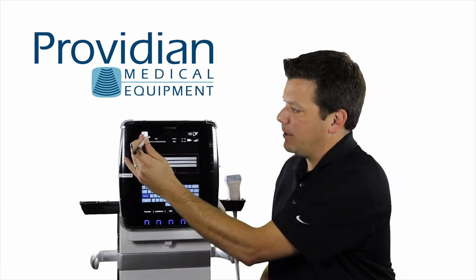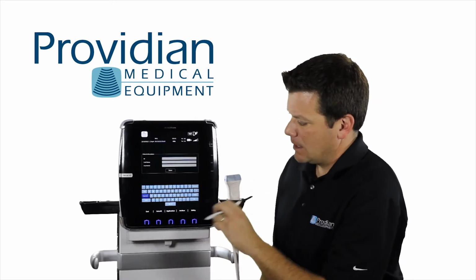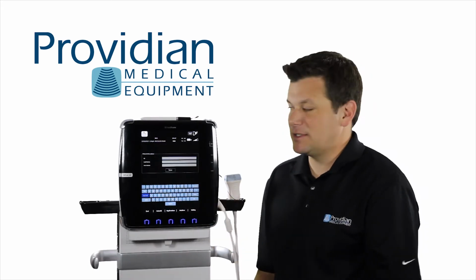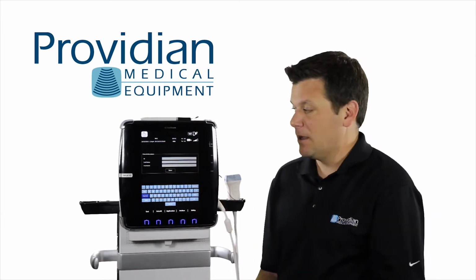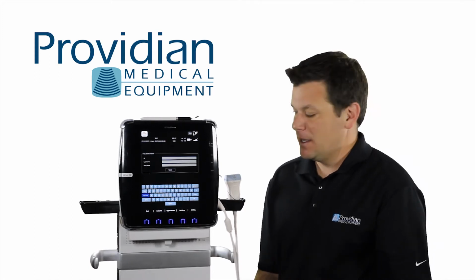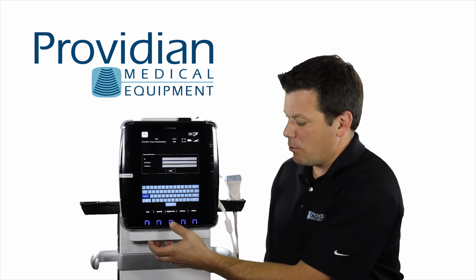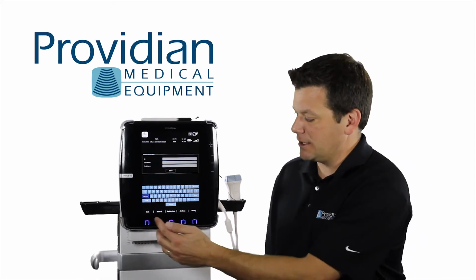We can click up here on the patient again. And notice when I clicked it the second time, we lost all that patient ID. Don't worry, it says test and that remains in there. The only time that's going to change is if I reboot the system or I enter a new patient ID. There really isn't an end exam here. It's just going to let you type in a new ID and that's going to start a new patient exam. Now, if I want to select application, it's going to reboot the system, and I'll show you that in just a minute. Let's get through this.